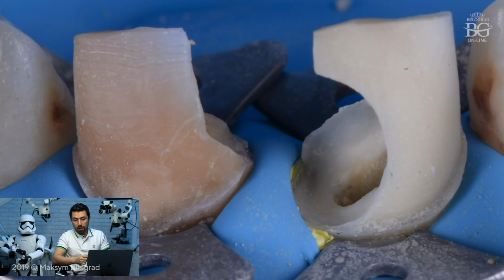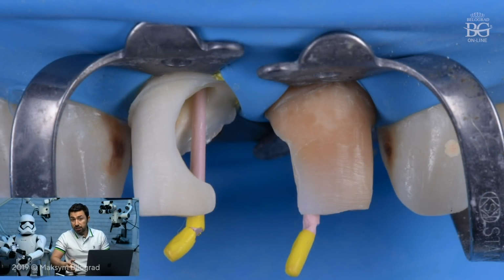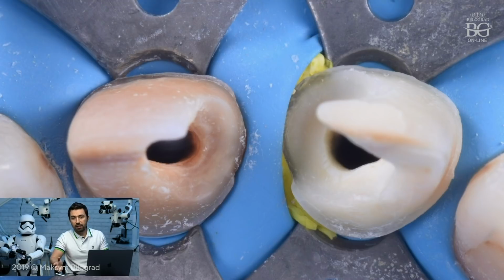So you can see here the view of the rubber dam displaced by the Teflon tape horizontally. Endodontic treatment itself was pretty simple. It was just removal of the Endomethasone or zinc oxide eugenol paste with ultrasonic, then cleaning with ultrasonic, with a lot of irrigation. Straight root canals, not very long, so it was not that difficult.